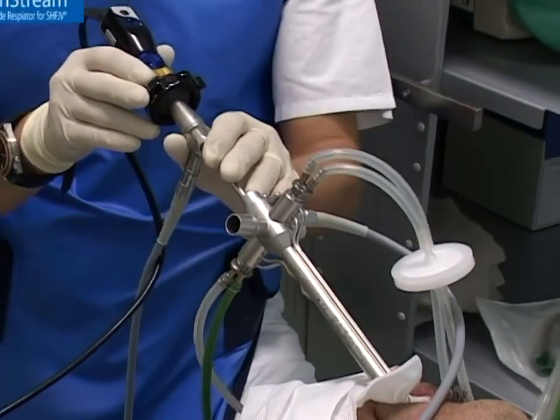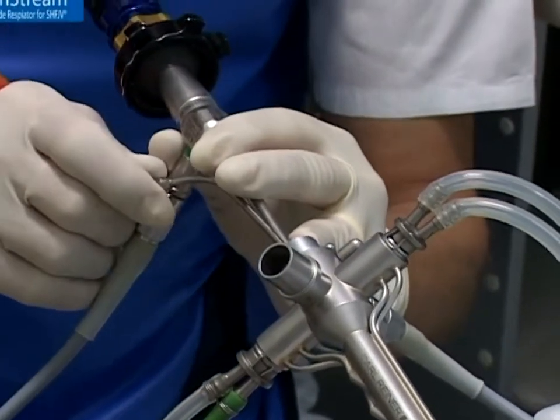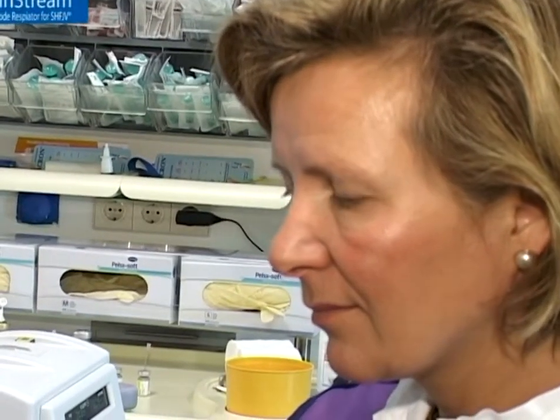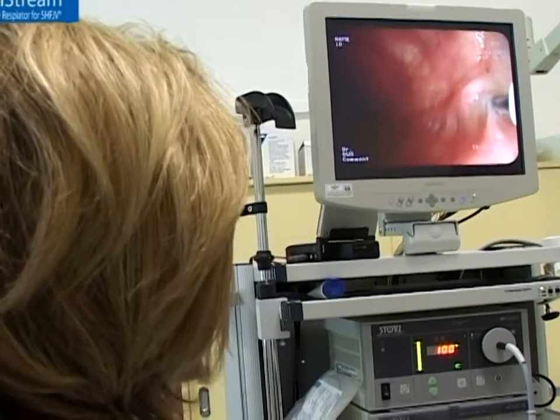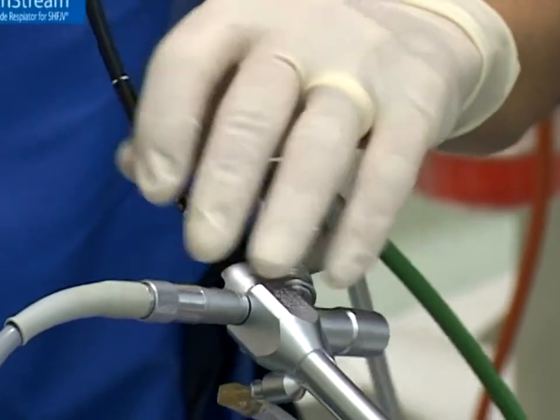Furthermore, it can also be used for the management of hemorrhage, for laser, argon plasma coagulation or cryotherapy. In recent times, the system has been employed for bronchoscopic lung volume reduction with valves. The technique of jet ventilation is a basic prerequisite for all of these procedures using the rigid bronchoscope. Only by this technique has it become possible to perform manipulations in the central endotracheal and endobronchial open system.